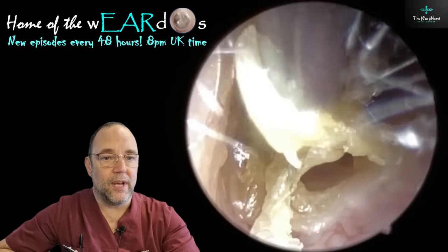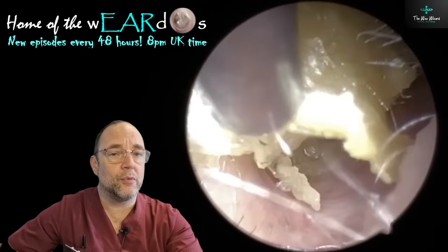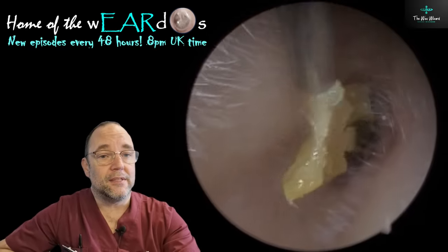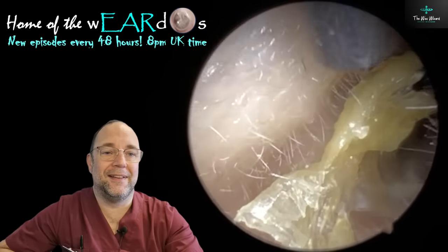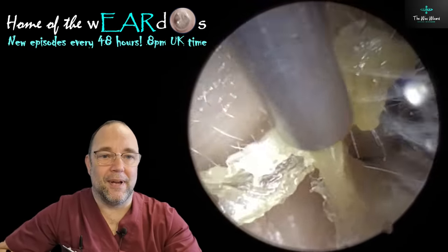The first one is the wife. They've got two ears from the wife and one ear from the husband afterwards, who, believe it or not, had his ears done four weeks before seeing me. You can probably see what's coming here already, can't you? It wasn't done properly at all.